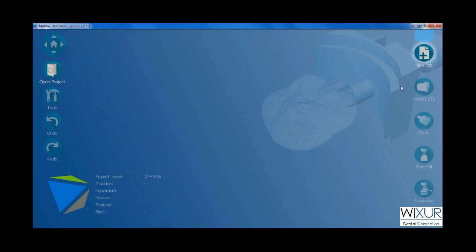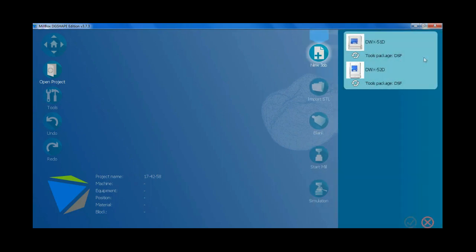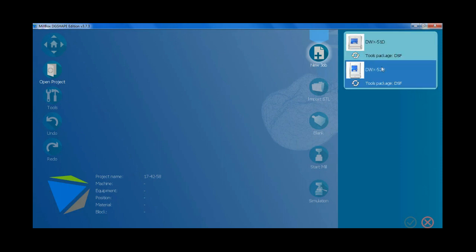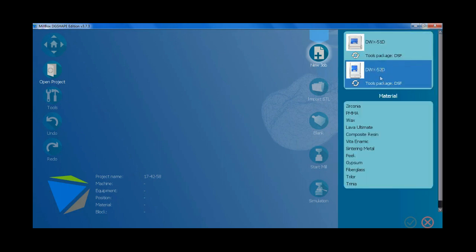Look at the menu on the right side. Click on new job button. Choose which milling machine to work with. Choose the production material.